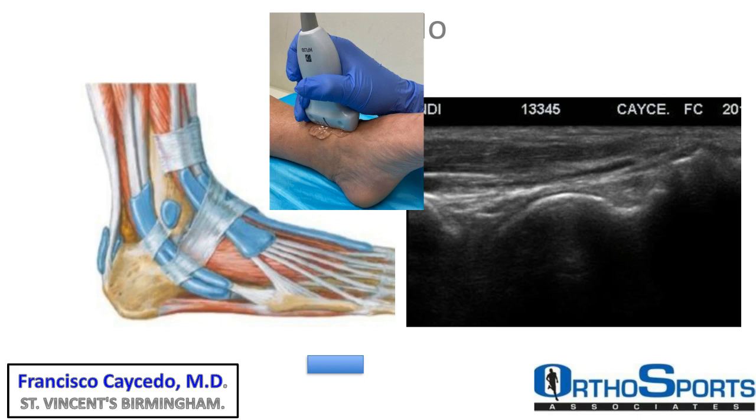So, as we said before, in my opinion, the Atlas of Anatomy Netter is one of the best to help us see what is under the skin, because that's what we try to see with these instruments: X-rays, CT, MRI, and now the ultrasound. The beauty with this one is that it is very dynamic and relatively low cost, and it is possible to do in the office and the surgical procedure, and it is very familiar now to anesthesiologists, rheumatologists, and pain treatment.